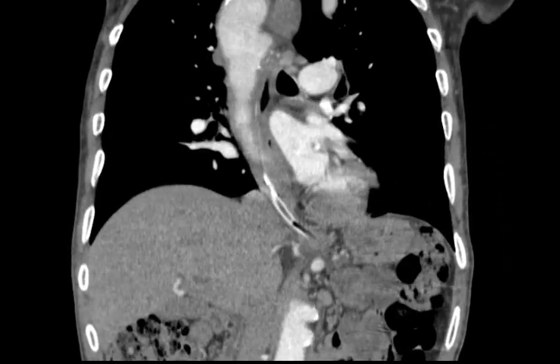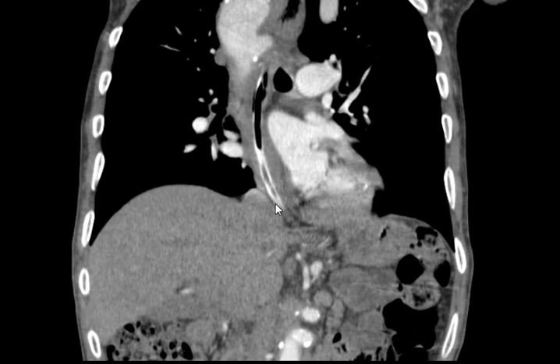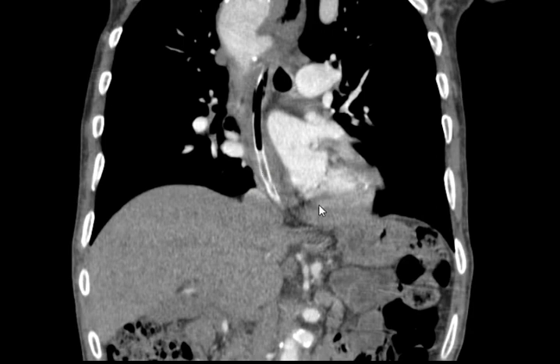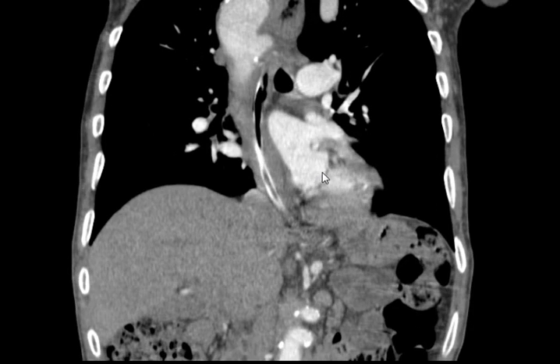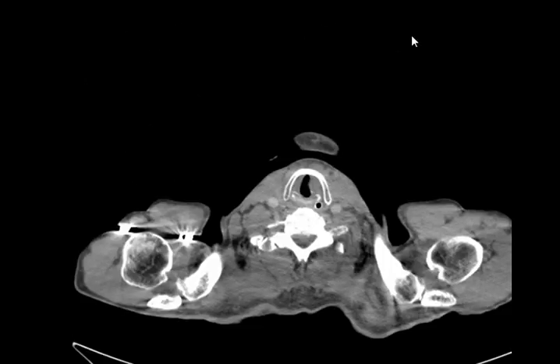Why would you commit yourself to esophageal thickening or not? Do an endoscopy, take a biopsy from the gastric mucosa and see the esophagus on the way. Well, I would not comment on it. I would not comment on the esophagus because the NG tube is there, so it's difficult to judge.